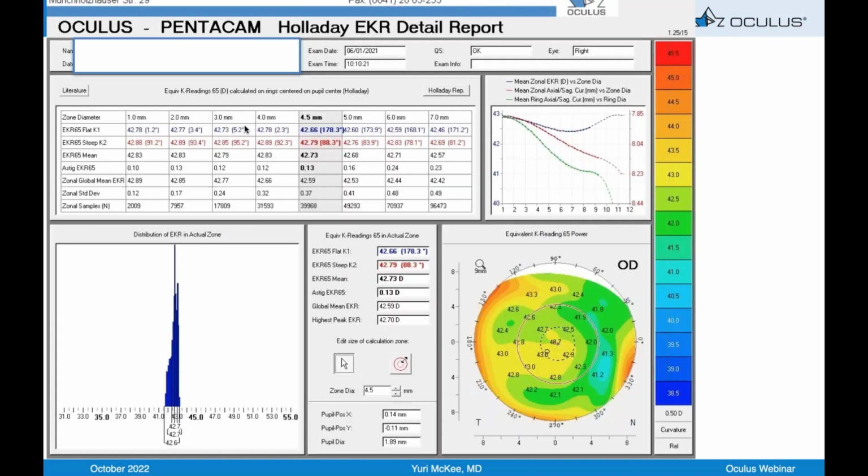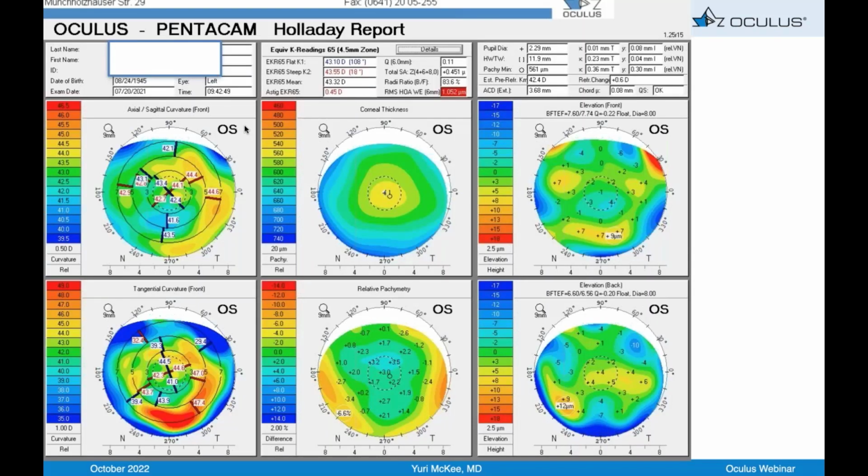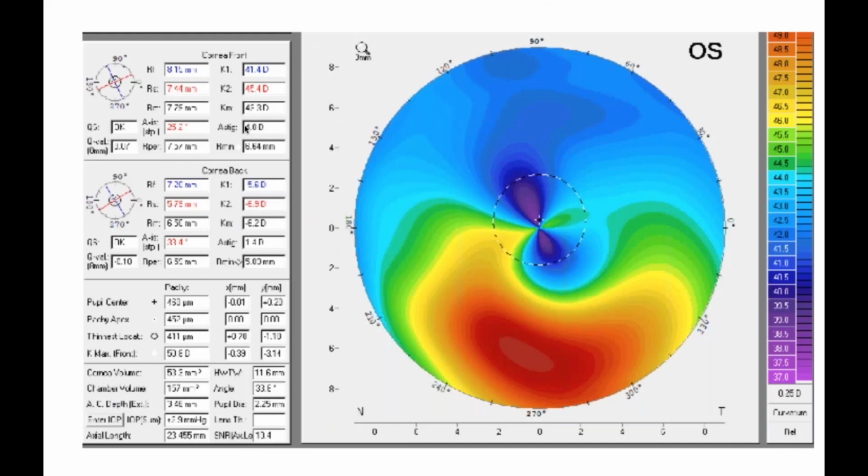Yeah, so let me fast forward to the keratoconus case I showed you there. There are 3 rules for placing a toric IOL. The astigmatism is regular, repeatable, and orthogonal. Obviously regular means that you're balanced between the right and left or up and down side of the steep meridian. And so in this case, we're not. We're largely imbalanced. And then the second one is repeatable. So I can see the same astigmatism that is regular across multiple tests. And then the third one is orthogonal. So is the true steep meridian 90 degrees away from the flat meridian?